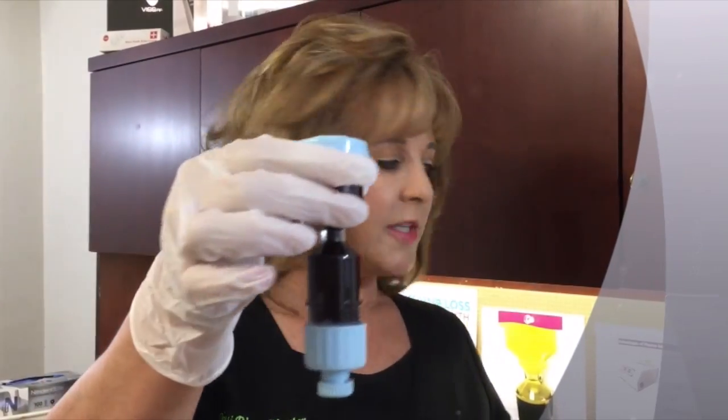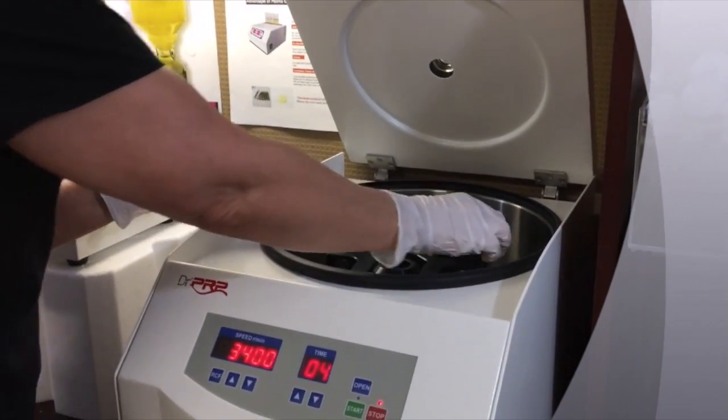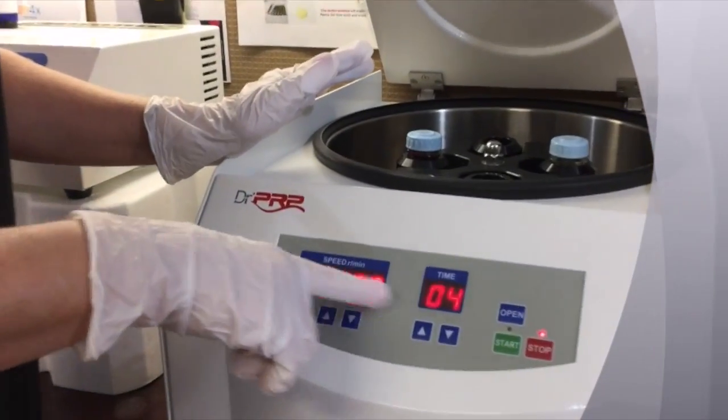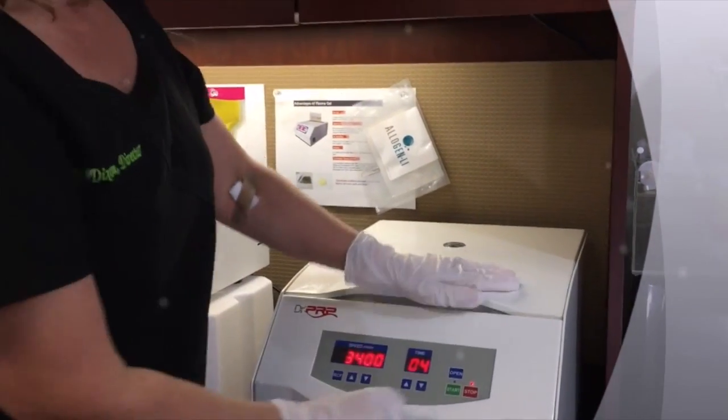Then you're going to take your blood sample and place it into your centrifuge directly across from your counterweight. You're going to set your timer for four minutes and your RPMs for 3400. Close the lid and hit start.